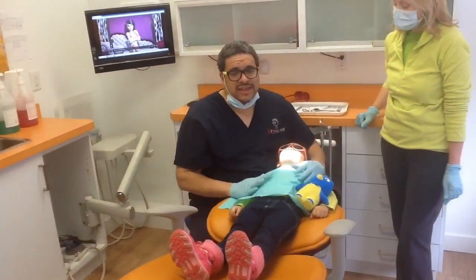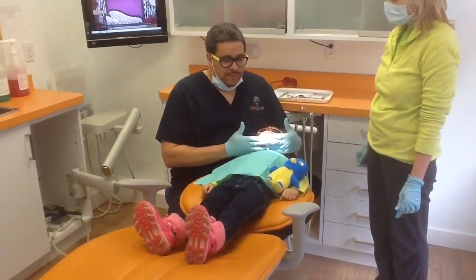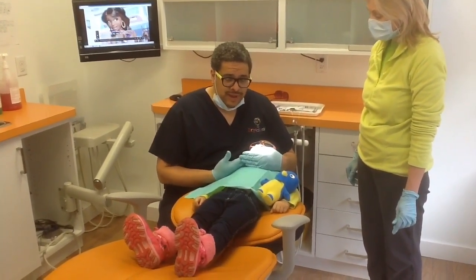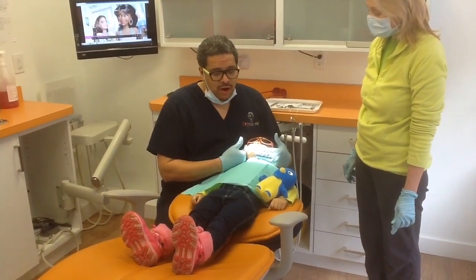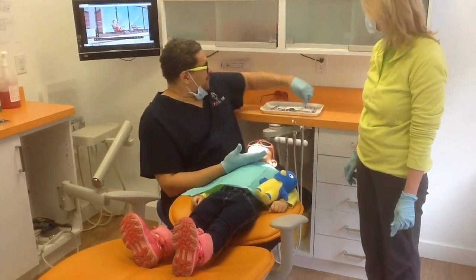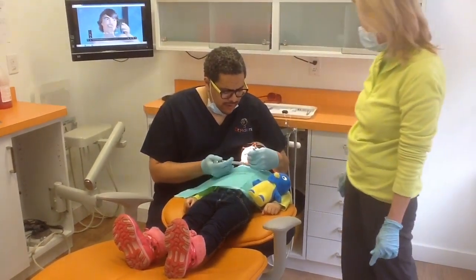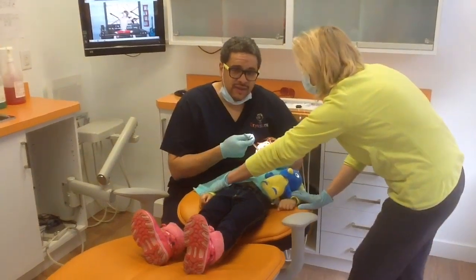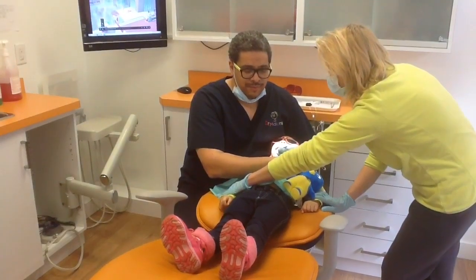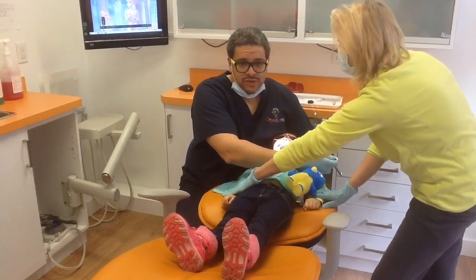Very often kids can get hurt during an injection, so it's very important to make sure nobody's pressing on the chest. If the patient is uncooperative, I can move in closely and give a gentle little hug so they're not moving their hands or head. You never want to press really hard — just snug enough so you can proceed safely. If they're really moving their arms, I can keep my arm here to protect as well. Notice that the tip of the needle is always away from the patient's face so nobody gets poked.